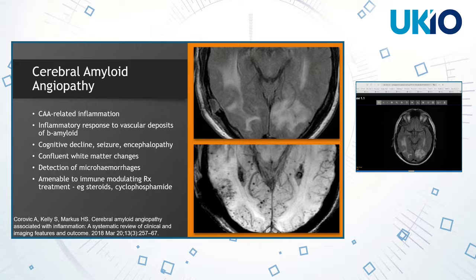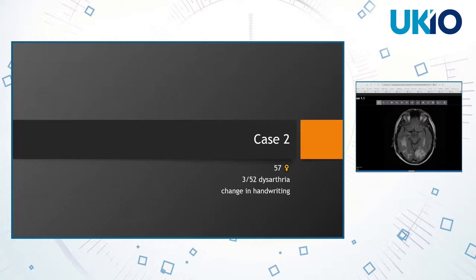Okay, so this is amyloid angiopathy-related inflammation. We see it probably a few times a year, and it's helpful to recognize.